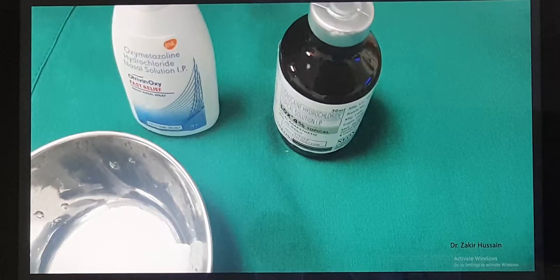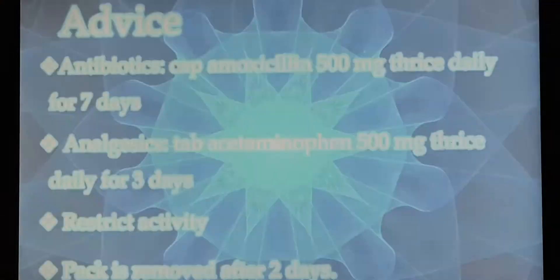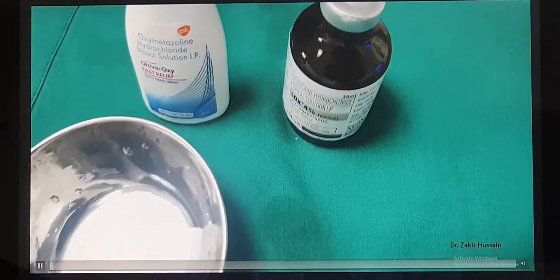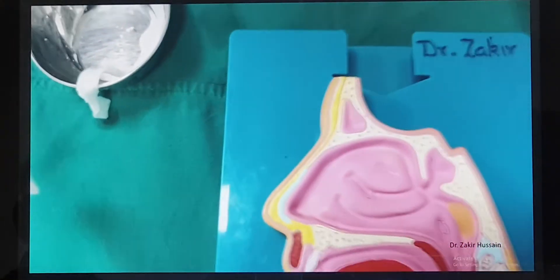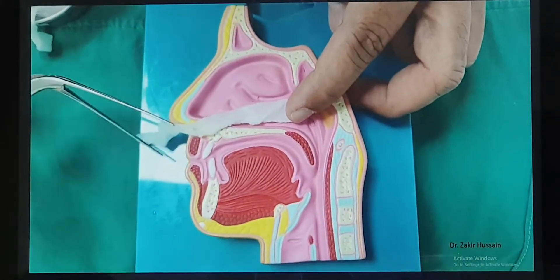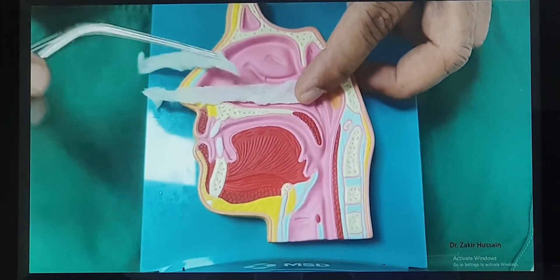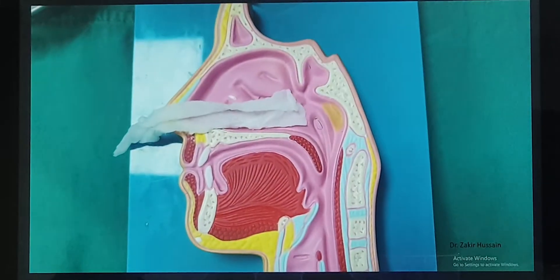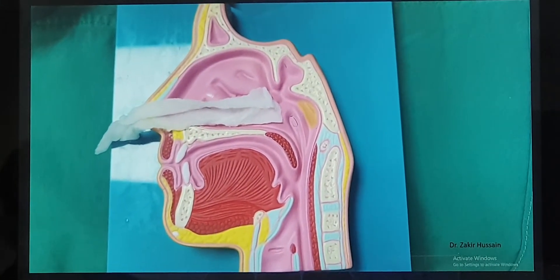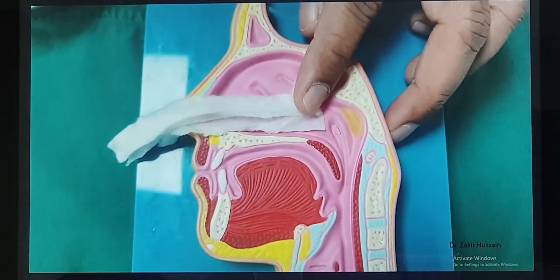Now let me give a small demonstration. For nasal packing we combine two medications as mentioned: a nasal decongestant and lignocaine (a local anesthetic). The cotonoids are placed in the nasal cavity — at least 3 to 4 cotonoids — and left inside for at least 5 minutes. We should be extra cautious with the nasal decongestant especially if the patient is a known hypertensive; sometimes we avoid it if the BP is very high. The second medication, lignocaine, is an anesthetic so the patient experiences less pain.